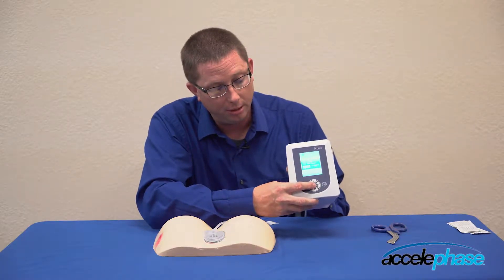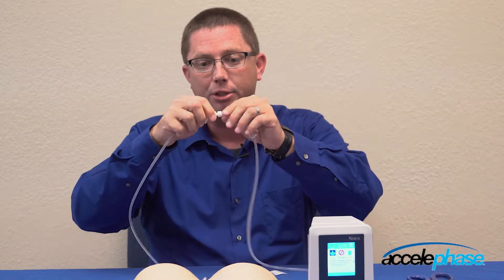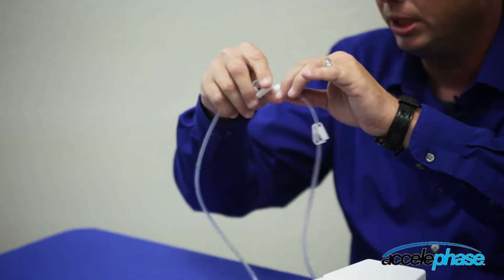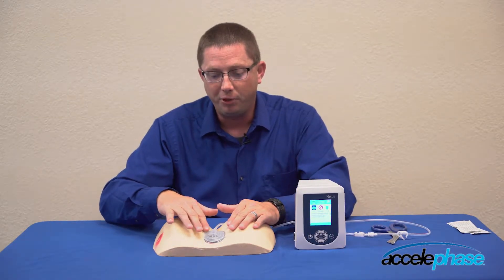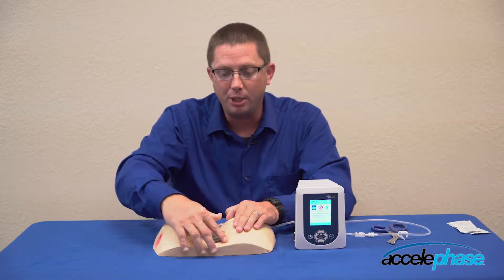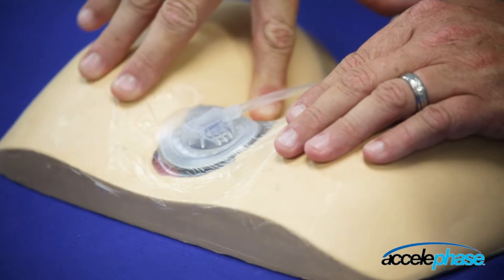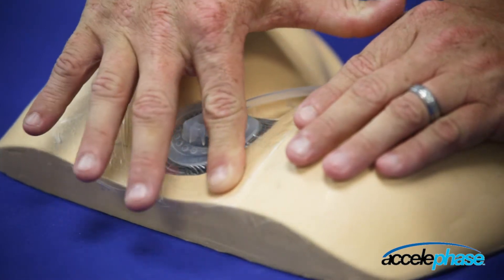I am going to mute the alarm. One of the first things I always check is to ensure the canister tubing is connected to the port pad tubing and that it is connected. I follow it back down to the dressing. I listen and feel for air leaks around the dressing, and I take my finger and try to reseal the wound around the peri-wound area to ensure the drape is still adhered.